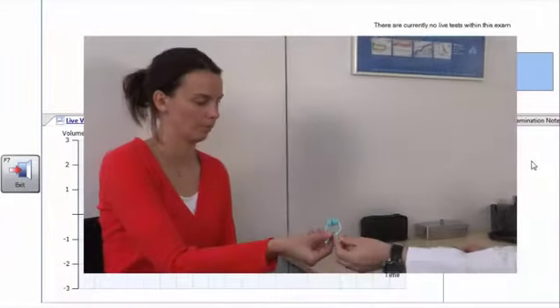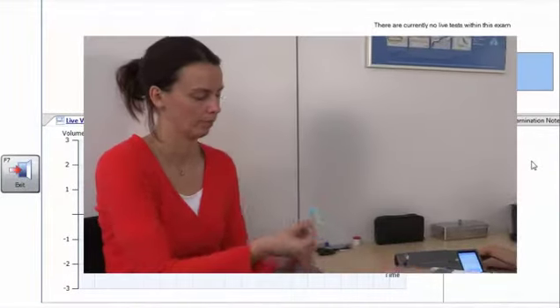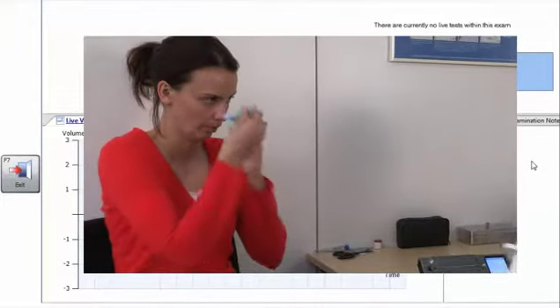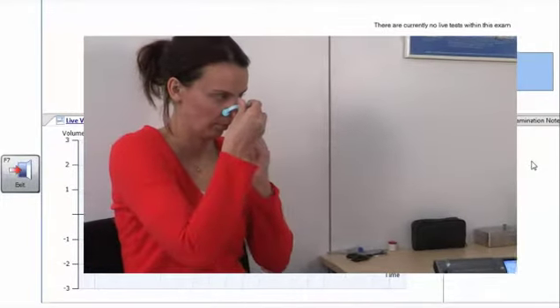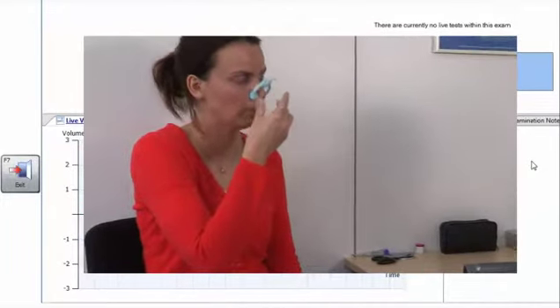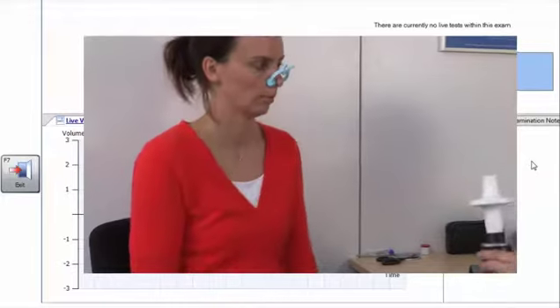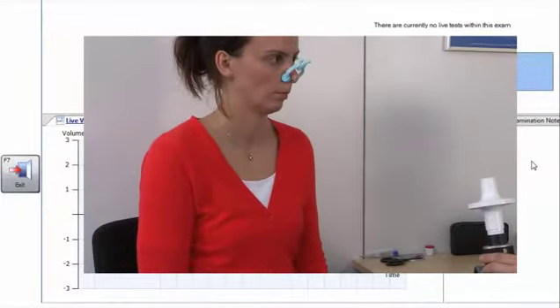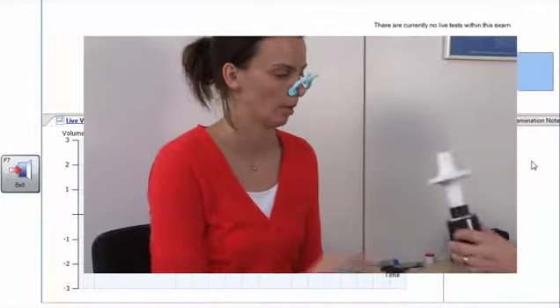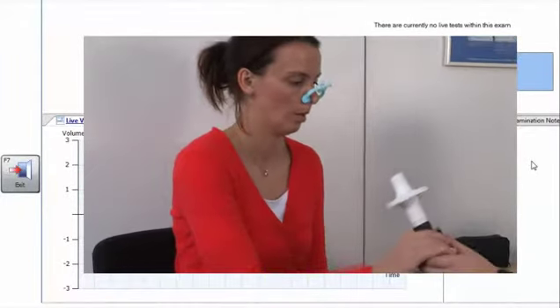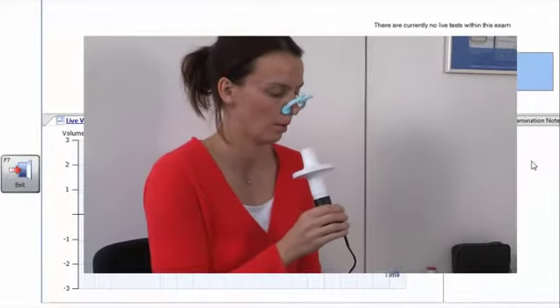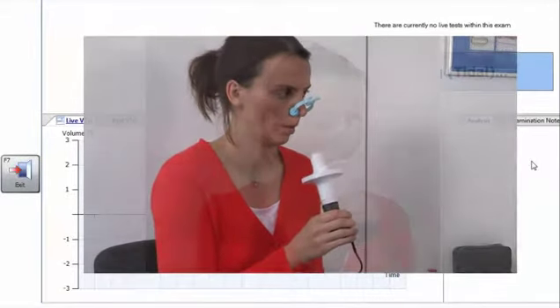With the patient seated, instruct them to place a nose clip on the nose and the microguard filter or mouthpiece into his or her mouth, with the teeth on the housing or mouthpiece and the lips pressed tightly around it to form a good seal.